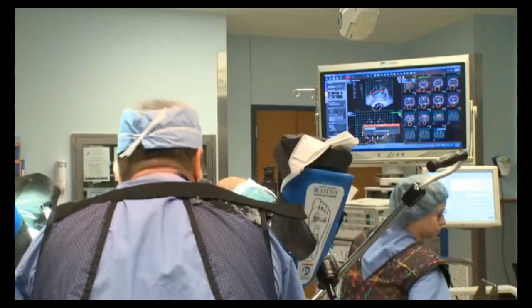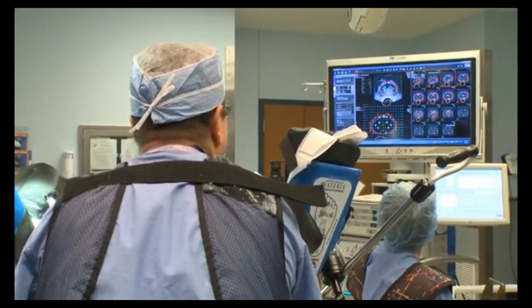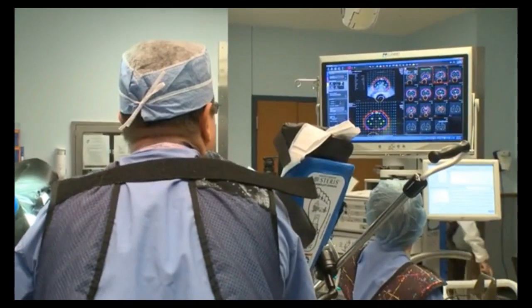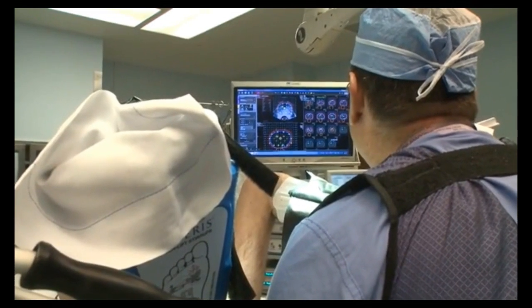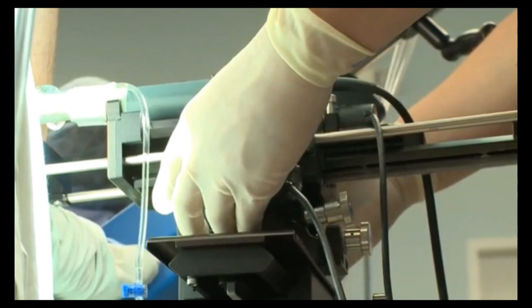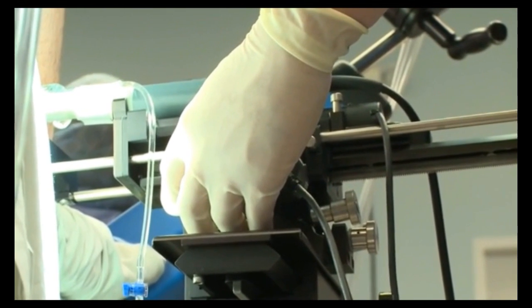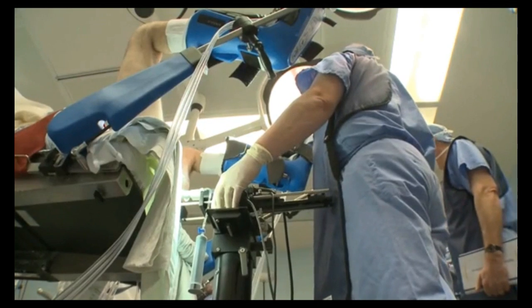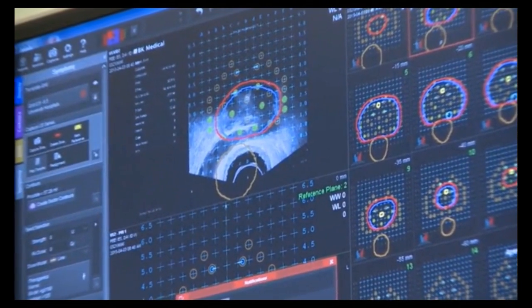I'm going to set my zero here. Ready for me to step back? There's my first slip back. Let me take my prostate up just a little bit. And that seminal vesicle I see on it. Let's go back to the next one. That looks pretty good. I think that'll get coverage. We may tweak the apex out. For the most part it lines up. It looks to me like the alignment's off just slightly. We'll capture new images on the prostate. I think I'll have to adjust. I could use those lines — I could just move and adjust and then we'll adjust the plan. Now I'm going to flip back, and it's going to track with me.